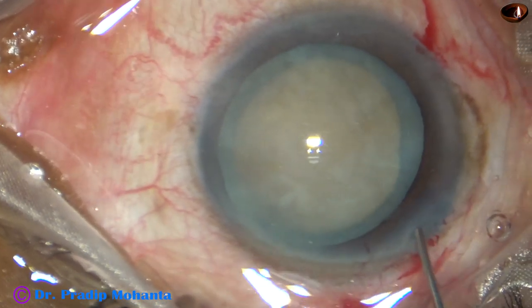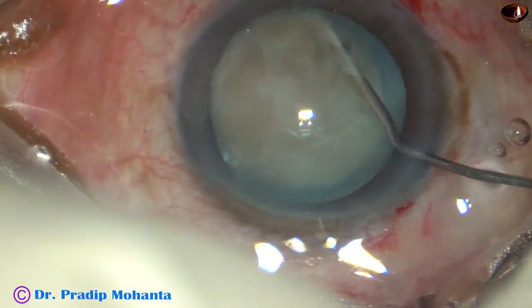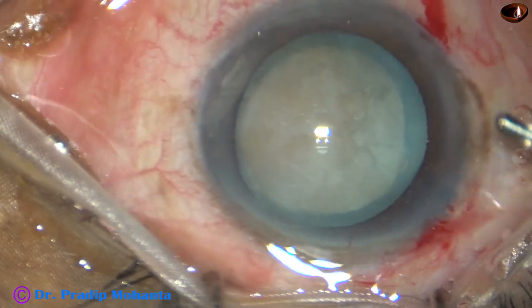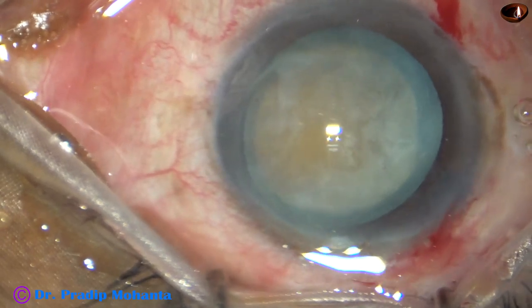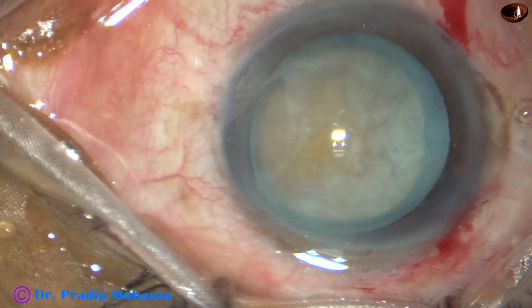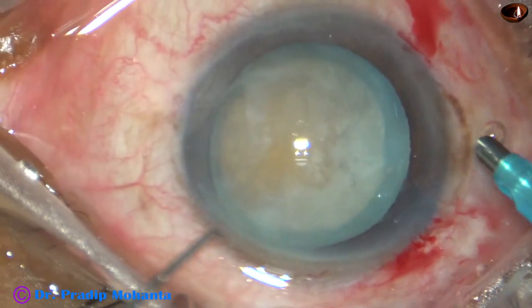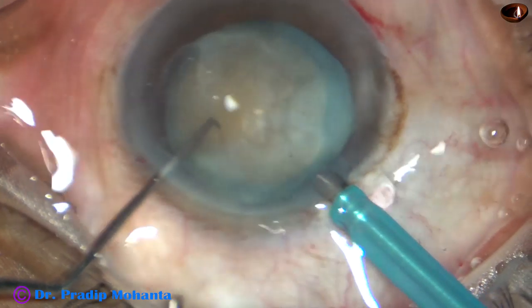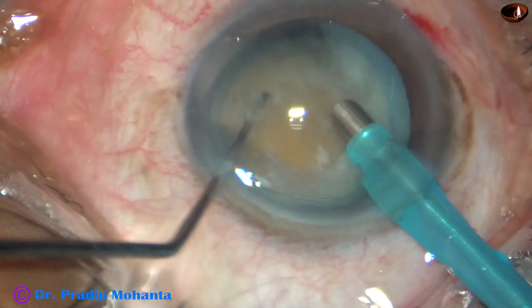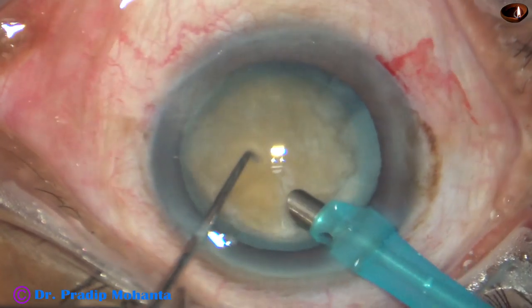Though hydrodissection is not necessary, I did a little bit of hydro and the nucleus rotated very nicely. We can see degenerated epinuclear material. This is actually a stage of cataract just before hypermature morgagnian cataract.